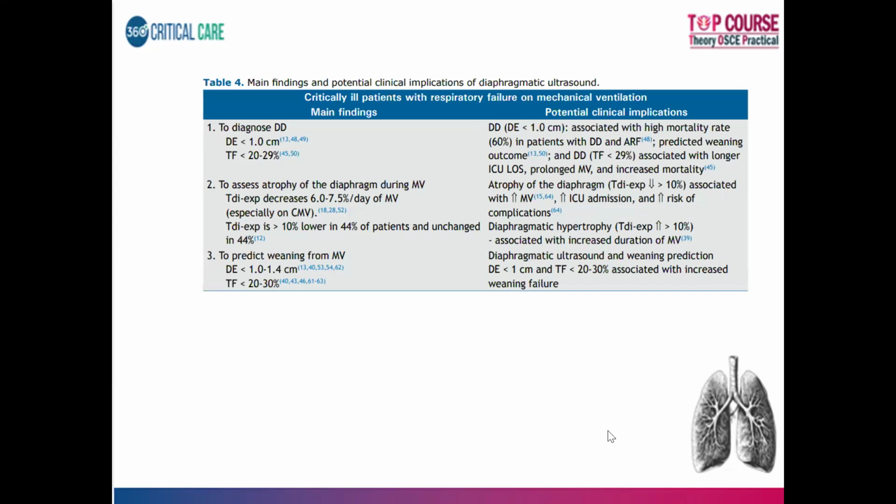All of them help us understand the overall functionality of the diaphragm and the probability of weaning these patients successfully on the ventilator. But still, these are under a lot of clinical trials, so to put them into daily routine bedside use is still kind of difficult.